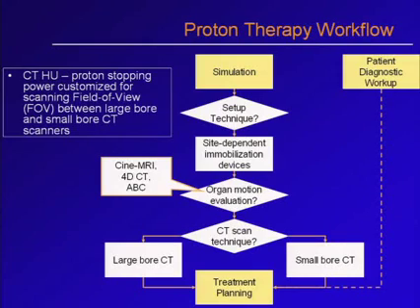So having an MR or access to MR is very important, because if you have a question of a moving target or moving structures within the patient's body, then you have to look at or assess what type of motion is going to be there in the patient.